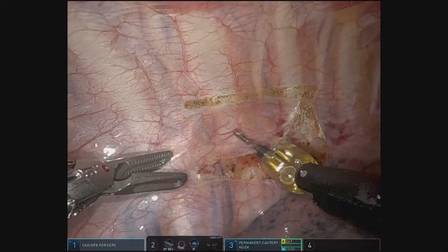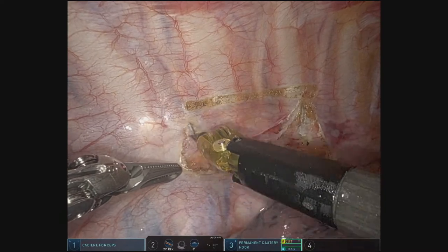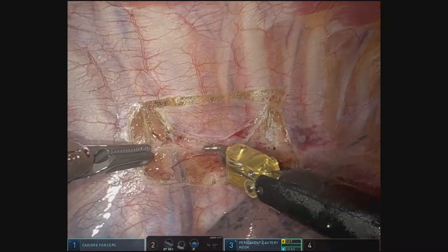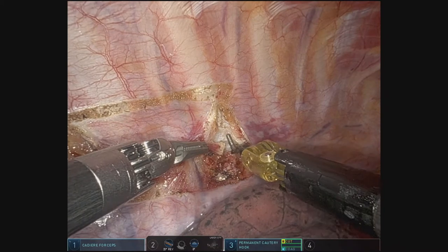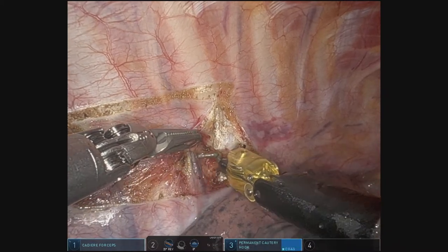Right there is the sympathetic chain. We'll go ahead and join the pleura here. Here we are ligating the sympathetic chain and then mobilizing it off of the chest wall. I do go lateral to the chain to incorporate any aberrant nerve bundles of Kuntz.